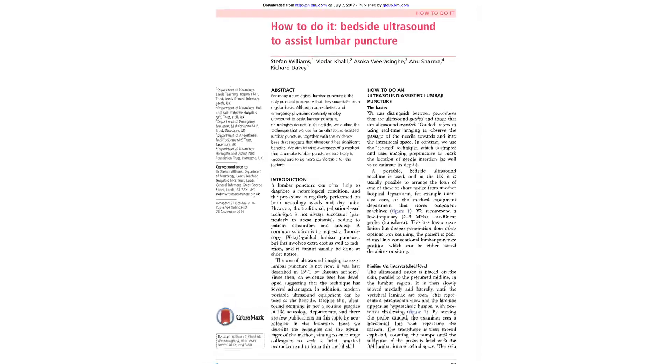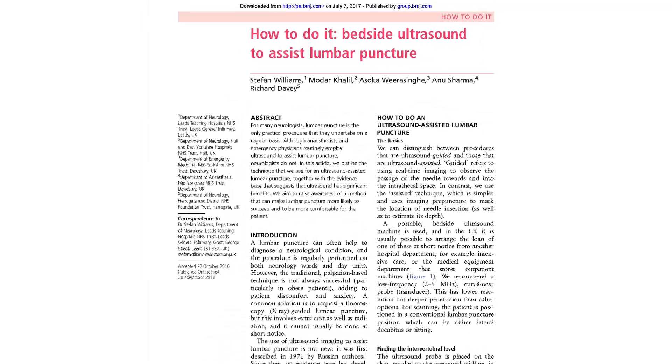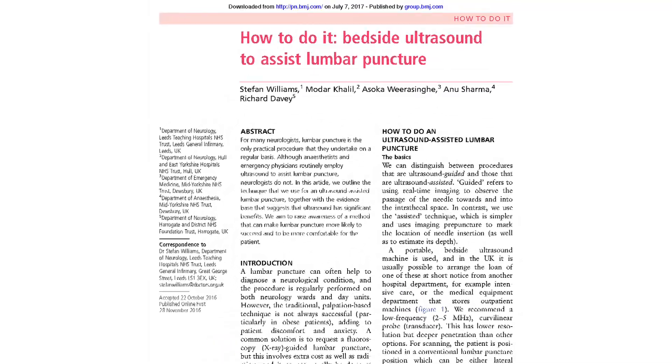Williams et al. give a good summary on how ultrasound can be used to help identify the anatomy as well as the depth of the dura. We will show you this relatively easy technique, which avoids radiation as well as often being quicker than referring on to another hospital specialty.